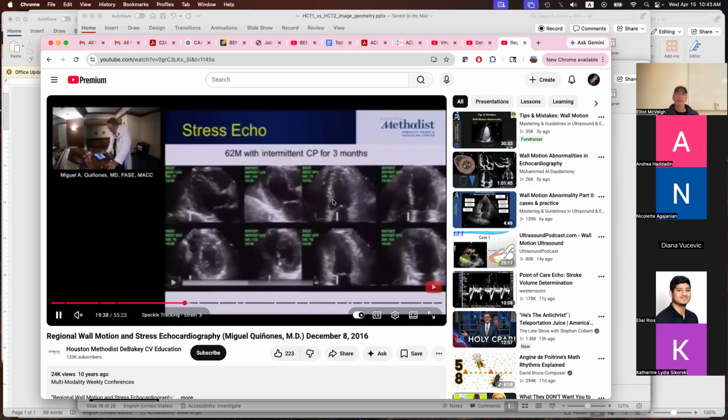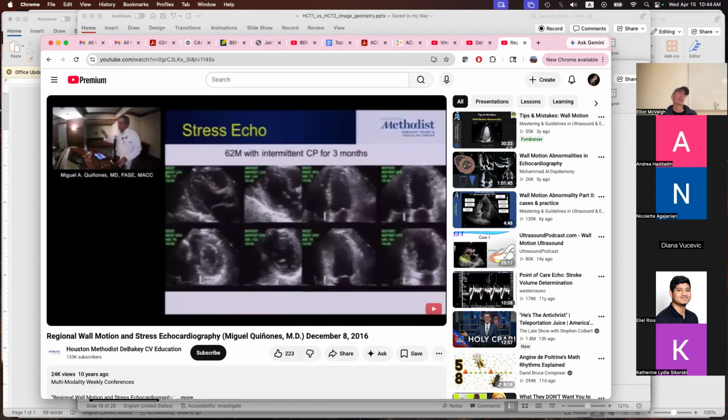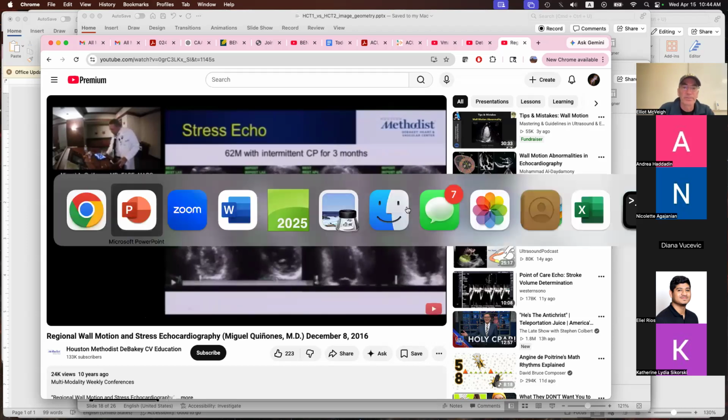From here. You look there and you say, oh, okay, that thing's moving, it's going well. And here now it's pretty passive and just moving. And so this is a case where you say right here, okay, that's positive. Now we can stop the test. You also know which area the contraction stopped, right? So that's kind of cool.